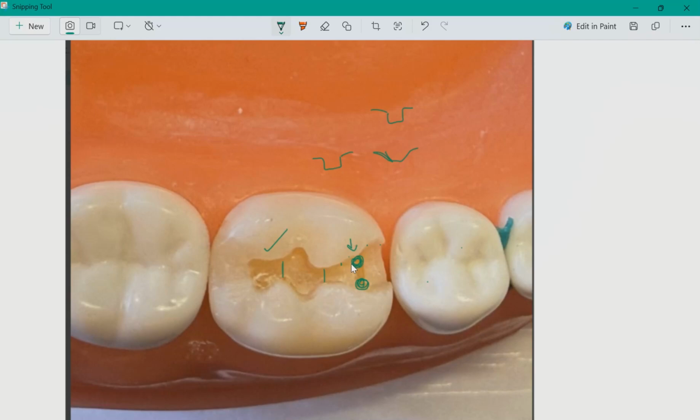If there's undermined enamel, you ask for another modification. Hopefully there's no undermined enamel or pulp exposure or anything, and you can just go ahead to fill. But overall, really good, much better. Things are much bigger than what you would think in some areas and much smaller than what you would think in other areas. Really good job.